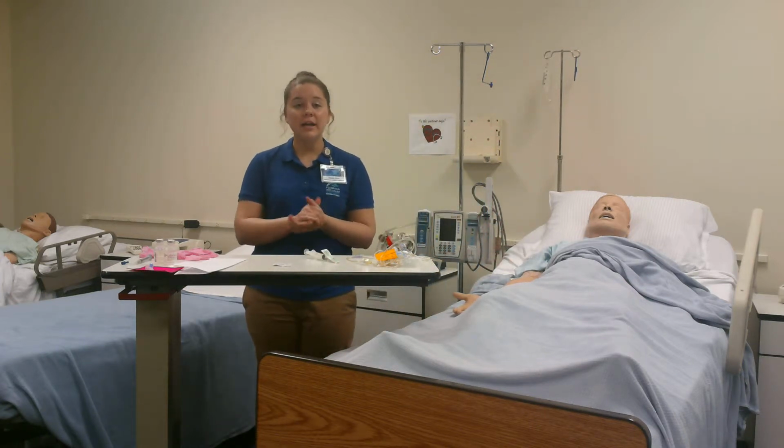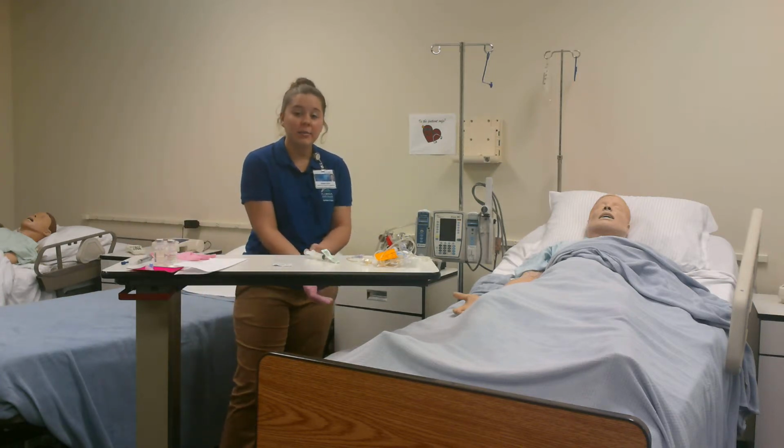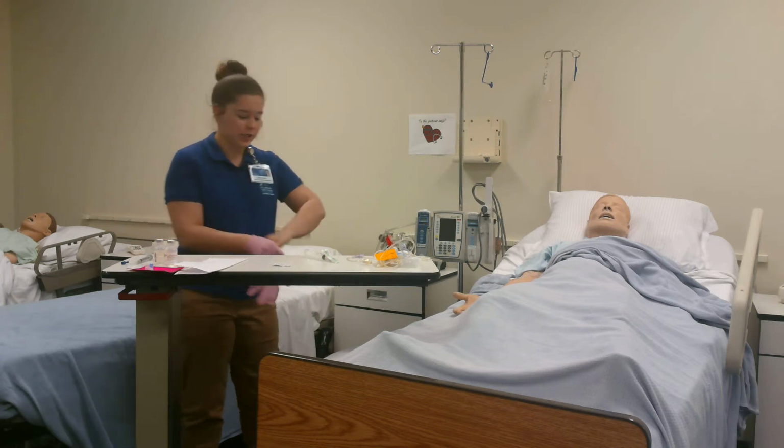Alright, I'm going to perform my hand hygiene, and I'm going to put my gloves on. And then I'm going to palpate the IV site for phlebitis and infiltration.